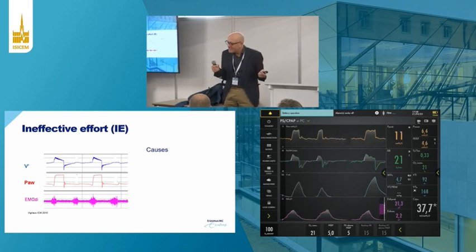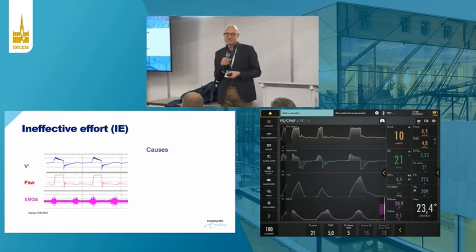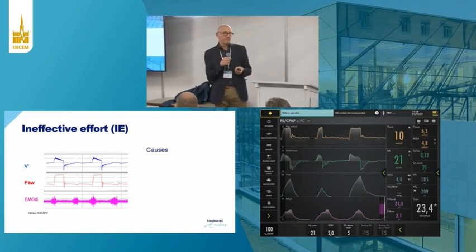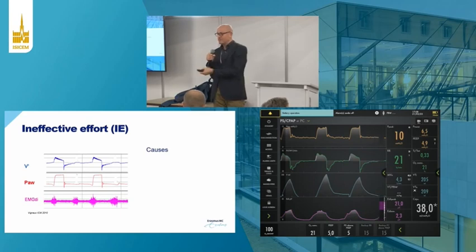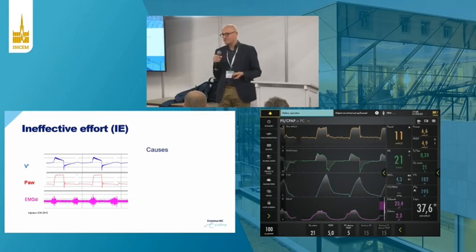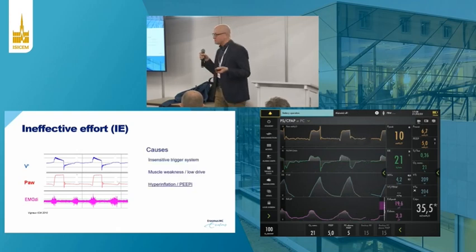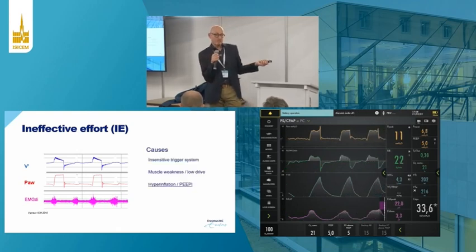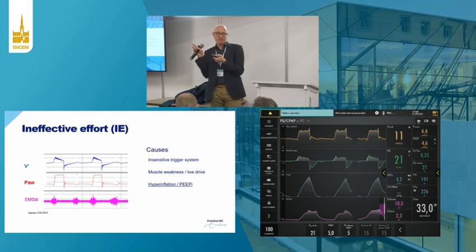Sorry? Oh, okay. Trigger sensitivity, sure. But I think that should be hardly a problem with all the modern ventilators, right? So second, more important probably, autoPEEP, that's very important. Anything else? So muscle weakness or low drive due to sedation. So these are the three things you have to consider when a patient has this kind of pattern.